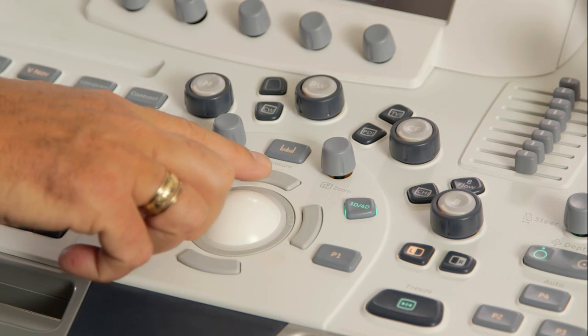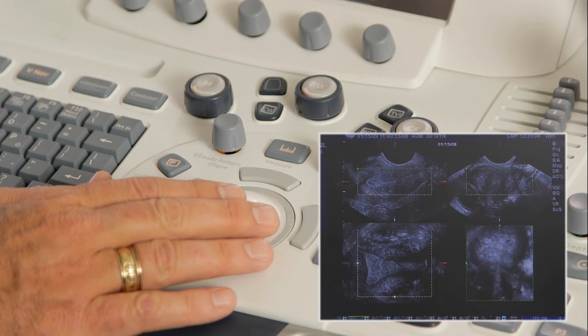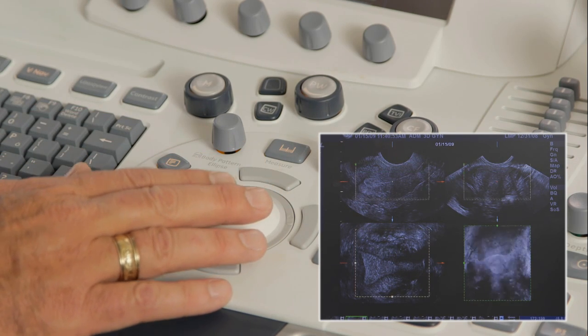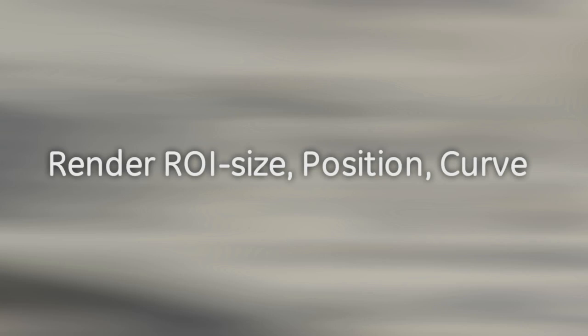Next, you will want to adjust the size and shape of your region of interest. Adjust the region of interest by selecting the north or top trackball key to resize the box, reposition the image into the render line, or to curve the render line into the anatomy of interest. Render: ROI size, position, and curve.